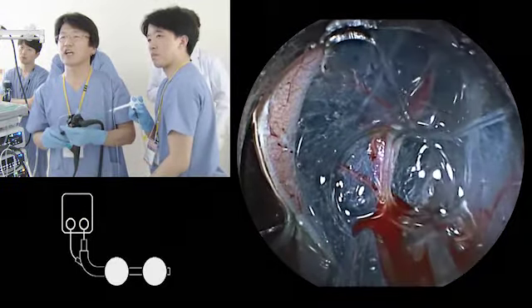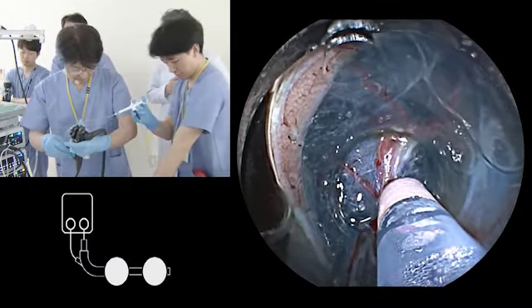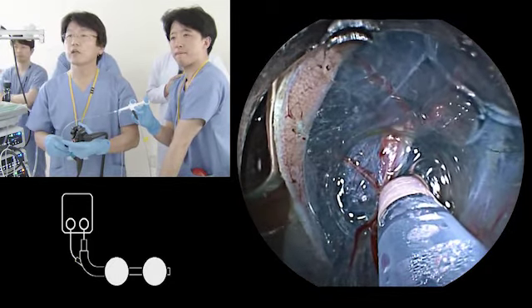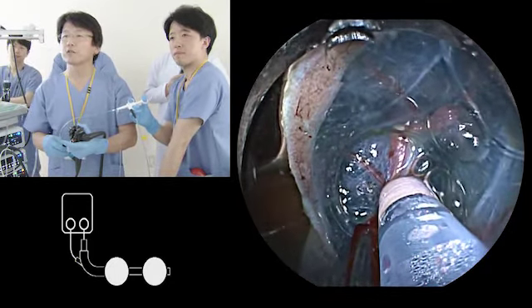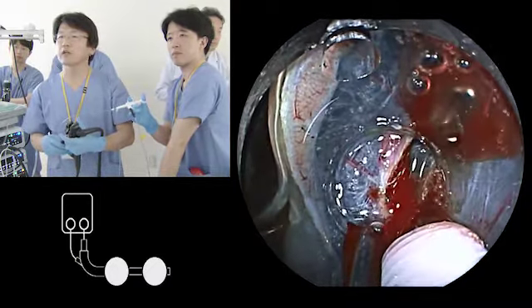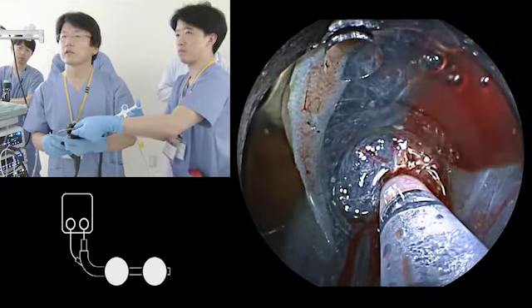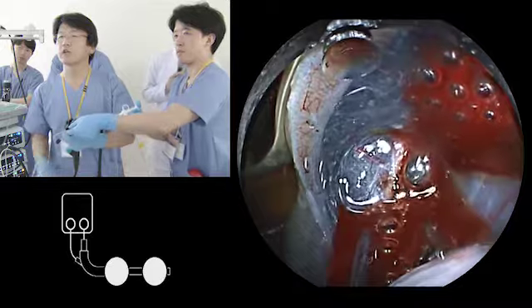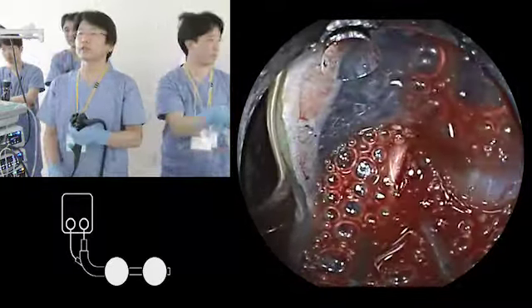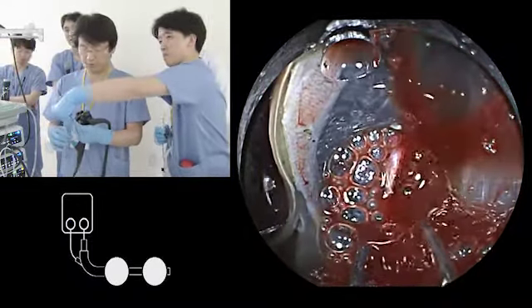But oh, it's attached. In this case, you can change to spray coagulation with a soft setting, only 0.7, and coagulate. Or you can use coagulation forceps. If this doesn't work very well, then it's better not to pursue too much, and then change to the coagulation forceps.